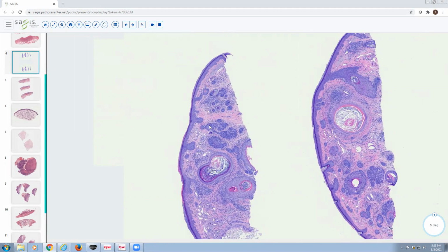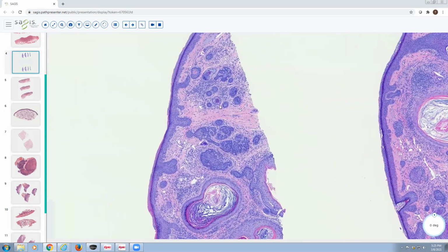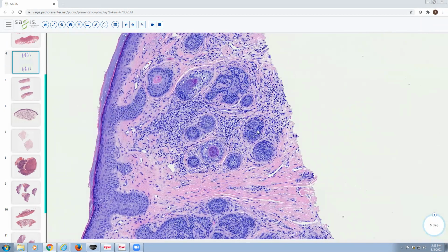And so the stains to know about for basal cell versus trichoep or trichoblastoma are CK20, BCL2, and CD10. So CD10 is going to stain the papillary mesenchymal bodies and the fibroblasts in the stroma of trichoeps and trichoblastomas. So CD10 would be positive in that cellular and fibrotic stroma and in papillary mesenchymal bodies like this here.